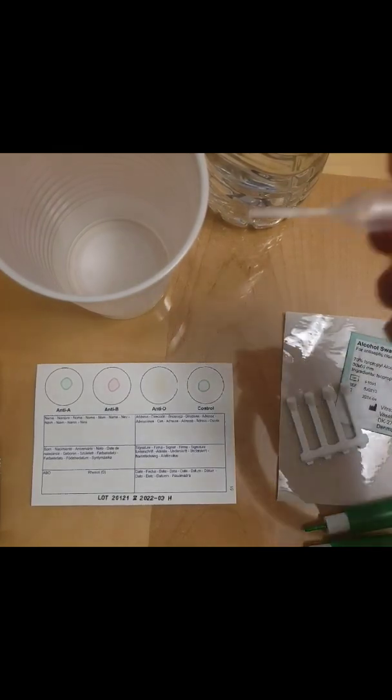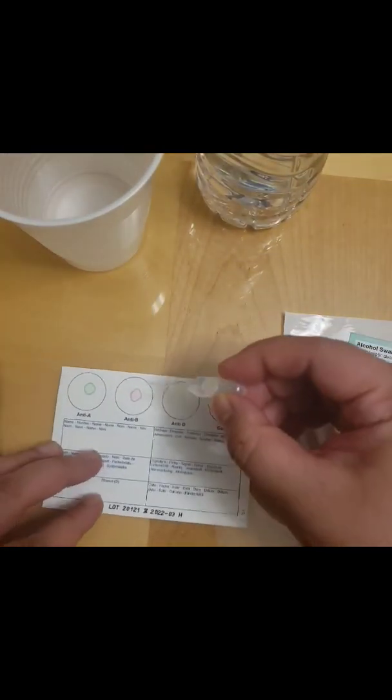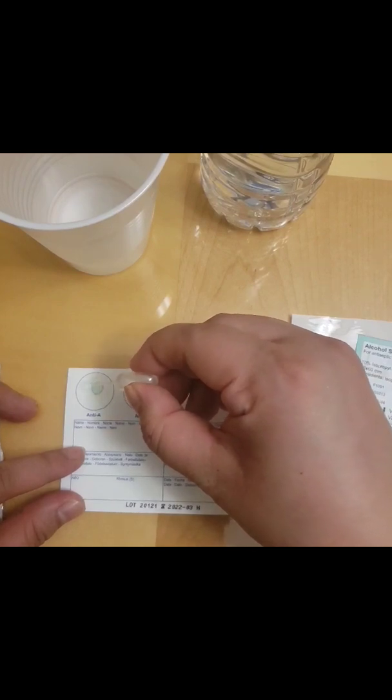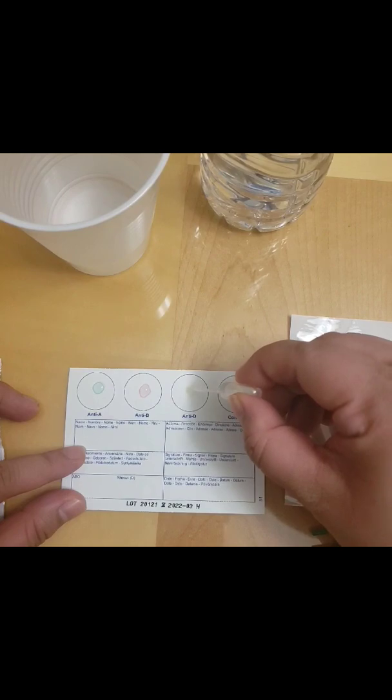First things first, we need to wash our hands and then apply one drop of water directly upon the colored region spot of each circle. You have to be careful to avoid any mixing between circles.